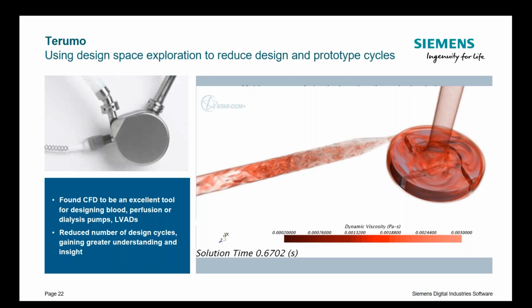And so we need to look at the design of the pump for combinations of shear stress level and transition time. And so we can use CFD as an excellent tool to design blood pumps, perfusion or dialysis pumps, and then evaluate new concepts. But we can further empower this method with design space exploration to look at competing objectives and come up with an improved design.